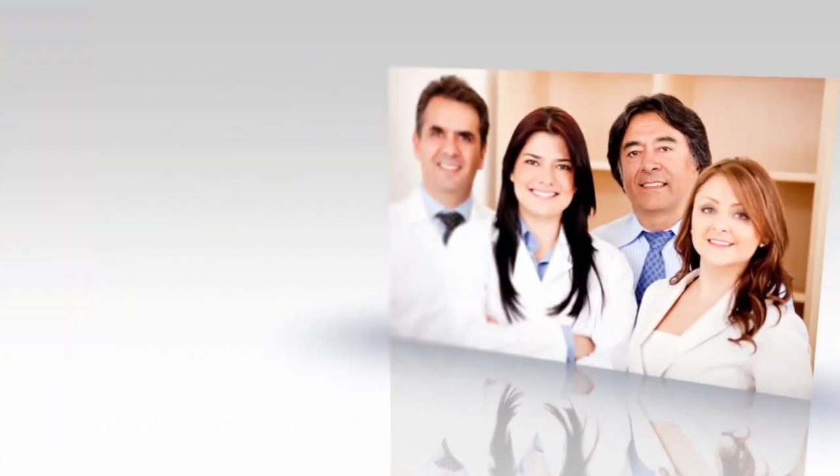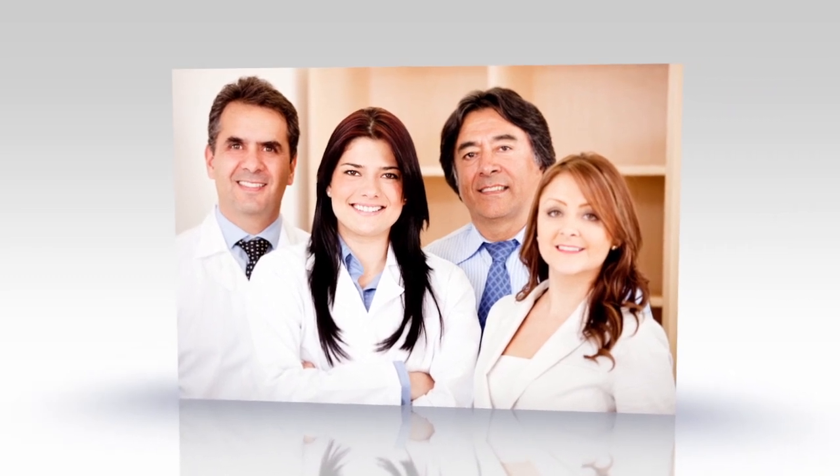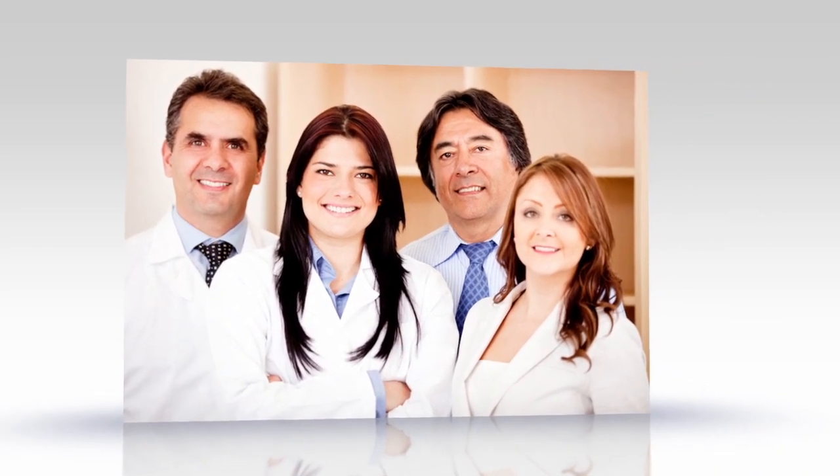The UroCuff system is a complete solution including all levels of staff training and education necessary to fully integrate the UroCuff into a practice.